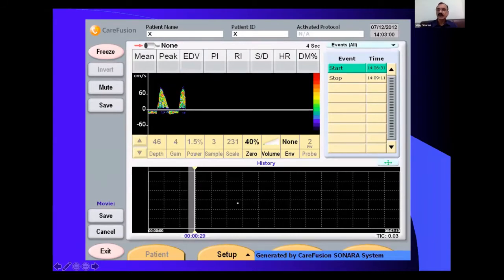And then after that, you ask the patient to do this kind of exercise. Do it for about a minute only. Wait for the patient to get tired. Once he says, my hands are tired, don't deflate the cuff, just remove the cuff, because you have to be sudden. And during that time, you are monitoring one of the intracranial arteries, can be vertebral artery, can be basilar artery, can be PCAs. So I was monitoring the distal vertebral artery.